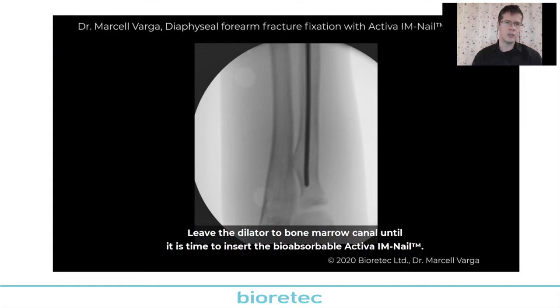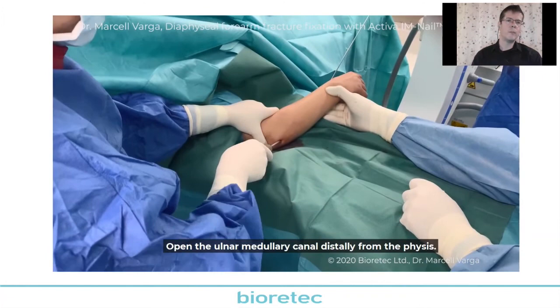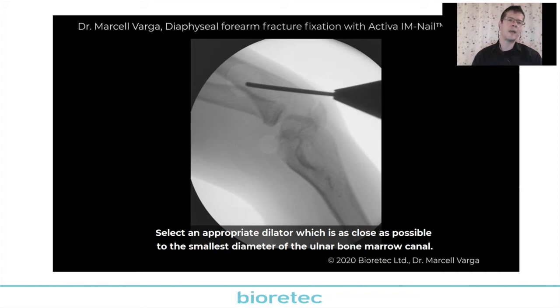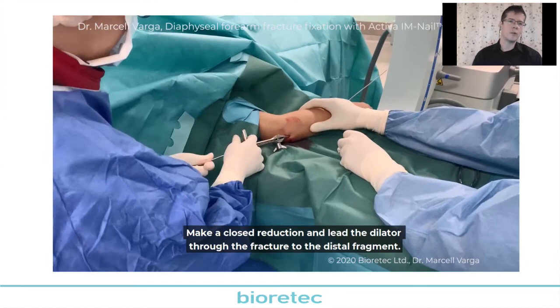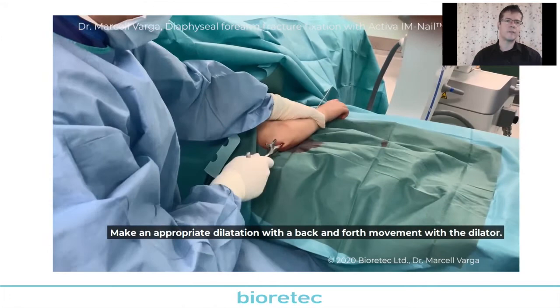I have to make enough space for the bioabsorbable nail, because with the bioabsorbable nail, I won't have the possibility to make my reduction. And if the nail becomes stuck in the medullary canal, I have to remove the bioabsorbable nail and try to make a dilatation again with a thicker dilatator. So here we can see as I make the ulnar dilatation with this back and forth movement to make enough space for the bioabsorbable nail.